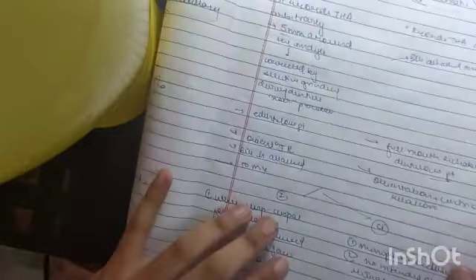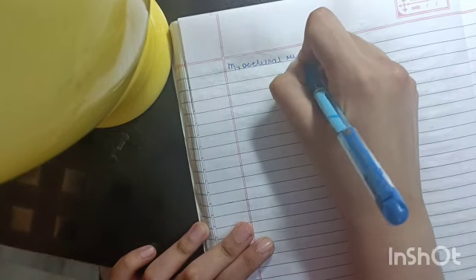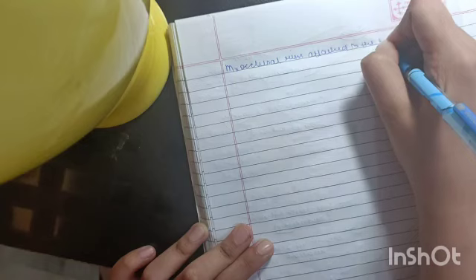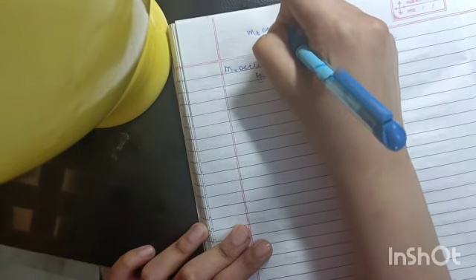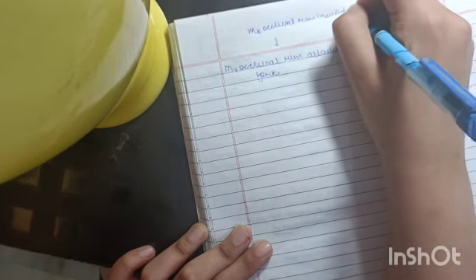So now coming on to how to record and transfer the face bow. First of all, we will insert the maxillary occlusal rim attached to the bite fork. First, we will contour the maxillary occlusal rim inserted in the patient's mouth.